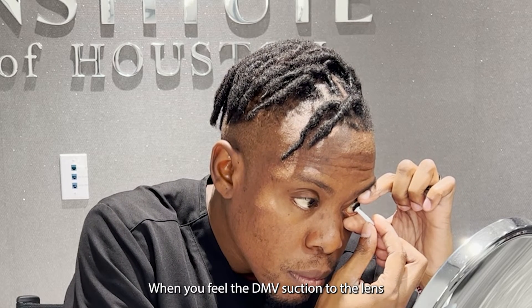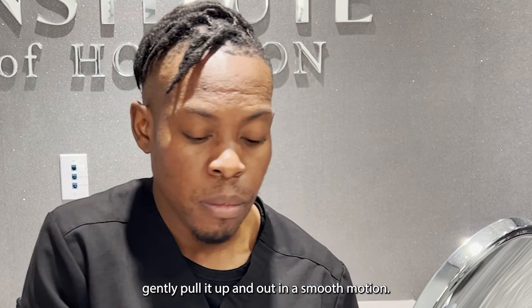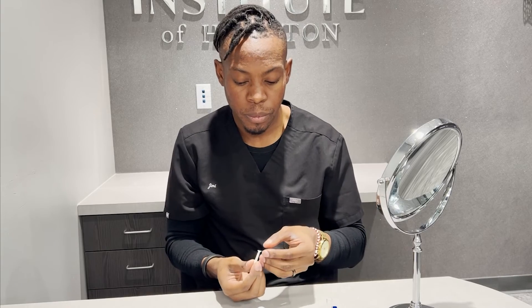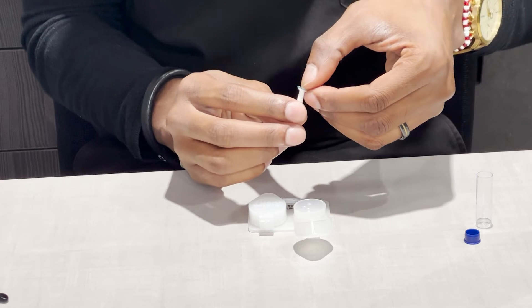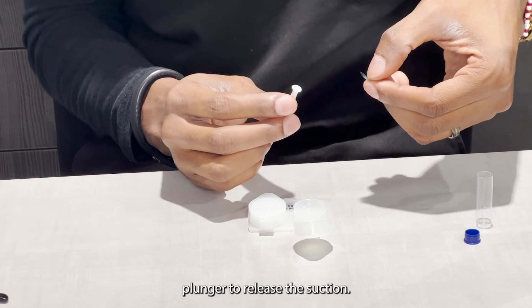When you feel the DMV suction to the lens, gently pull it up and out in a smooth motion. Carefully slide the contact lens off the DMV plunger to release the suction.